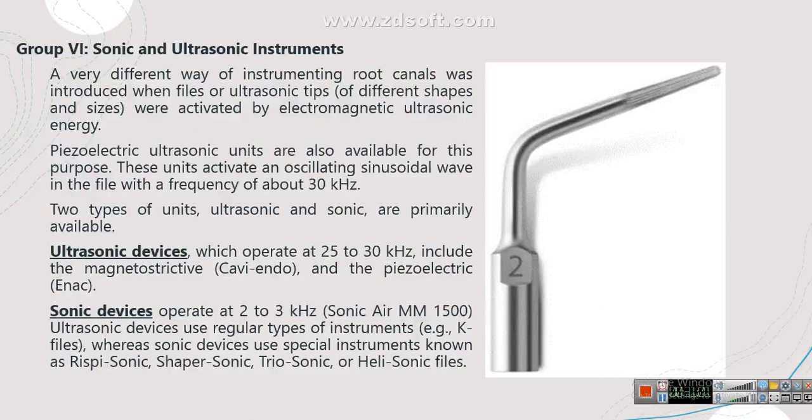By the way, different resources or different textbooks may mention different types of sonic and ultrasonic activities. For example, the frequency of the ultrasonic instrument, from the frequency point of view, gives around 40 kilohertz, and the other one is around 20.